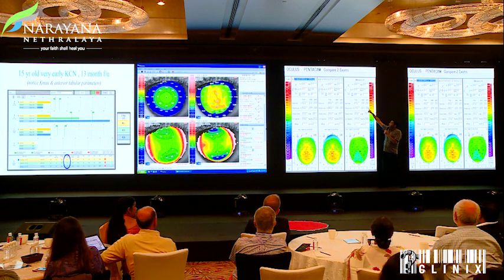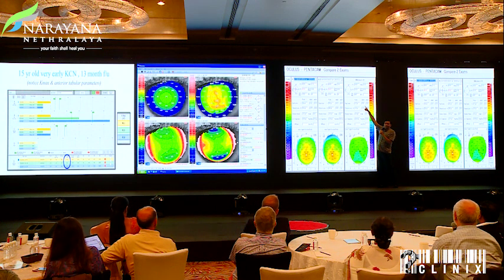Because you can see the difference is here, 0.50 is on the x-axis. It's a significant difference. But Rohit, look how the pupil has changed during the two measurements. So those measurements are not reliable measurements. You cannot compare those two measurements because there must be a measurement error. It was misaligned or something. So that 0.5 does not respect the fact that you may have not aligned measurements. Exactly. So this is what I wanted to bring up in this case.